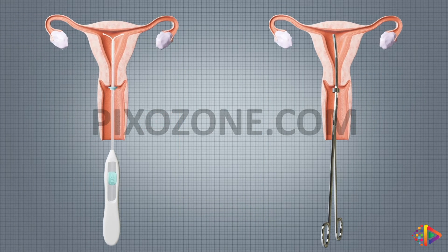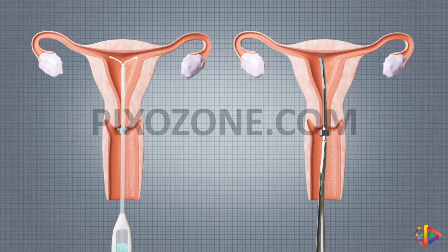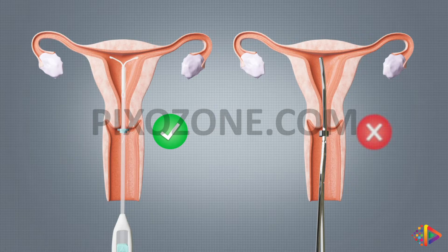It's important to note that, unlike the flange of an IUD inserter, which is designed to reach the external os of the cervix, the flange of the IUD remover need not be advanced to the external os.